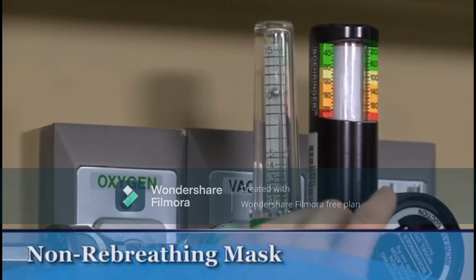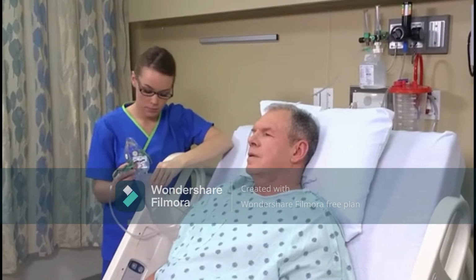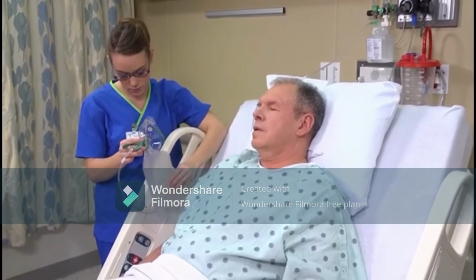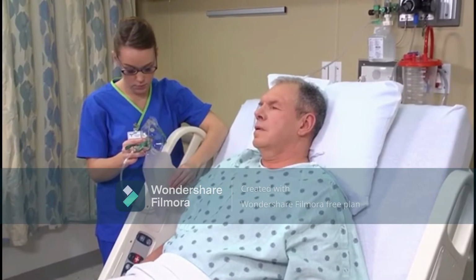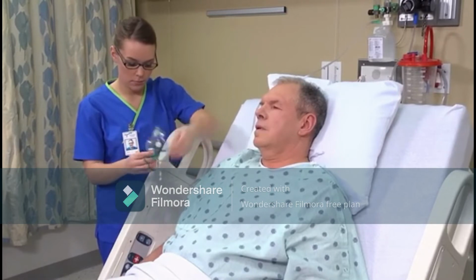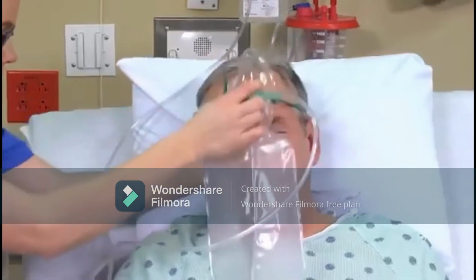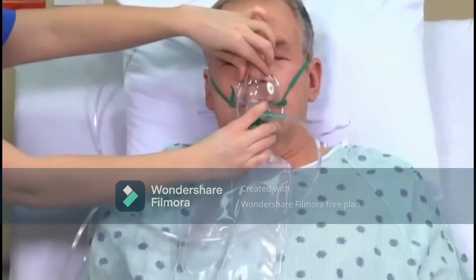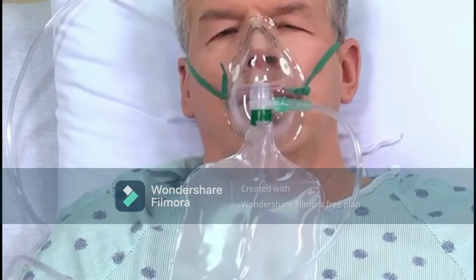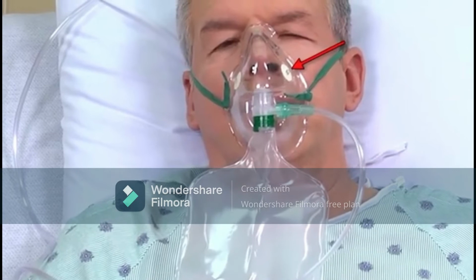A non-rebreathing mask is equipped with valves that prevent exhaled air from entering the reservoir. Once the oxygen has been turned on, the bag will remain inflated. Confirm that oxygen is flowing, and then place the mask over the patient's mouth and nose. Put this around your head. Note that a partial rebreather has one of the valves removed.